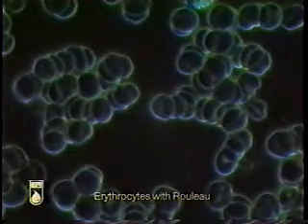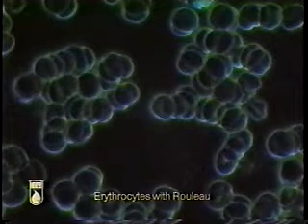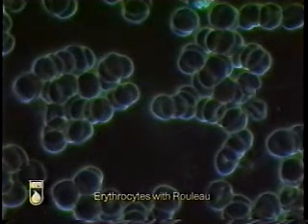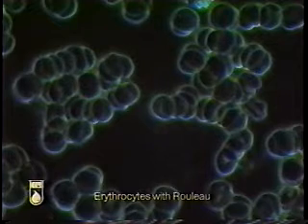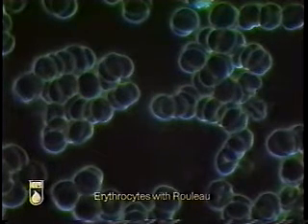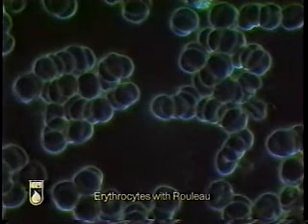Sometimes abnormal proteins, globulins, or toxic substances can become bound to the membranes of erythrocytes. When this happens, they begin to adhere together, and the red cells will form a typical stack of coins formation, which is also referred to as red cells with rouleau factor.